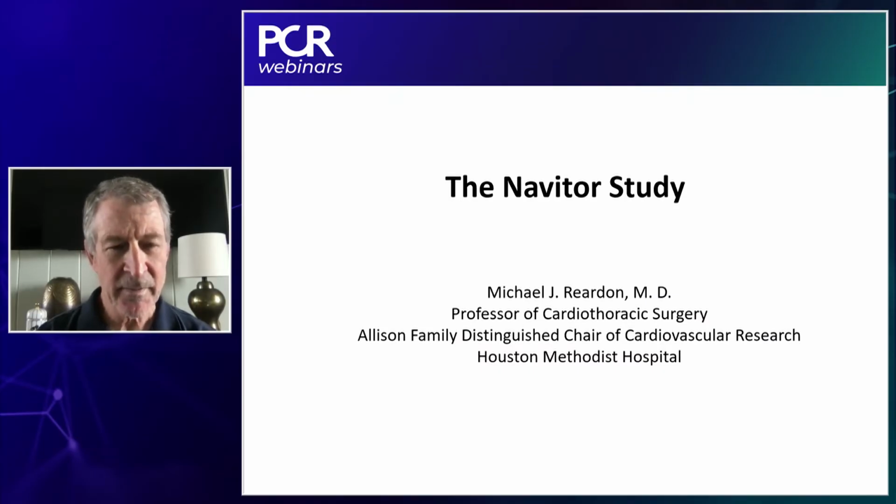Well, maybe before I do that, Lars, if I can just comment on your case. First of all, that was an excellent case. You made a comment about the spread between diastole and LV-EDP. Of course, your pre-measurement was done at a heart rate of 107 and the post was 64. I think if you paced them up, that would have disappeared. I think this was an absolutely stunning outcome.